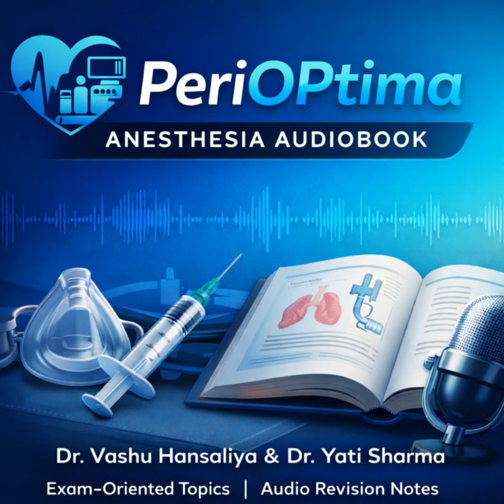Complications of direct laryngoscopy. We've hit on dental trauma, but let's cover the full spectrum. As we've stressed, dental trauma is the most common mechanical complication, and it almost always happens because of the fulcrum error, using the teeth as a lever. Yes. You can also get soft tissue injury to the lips, the gums, the pharynx during insertion, and then there are the physiological responses. It's a very stimulating procedure.